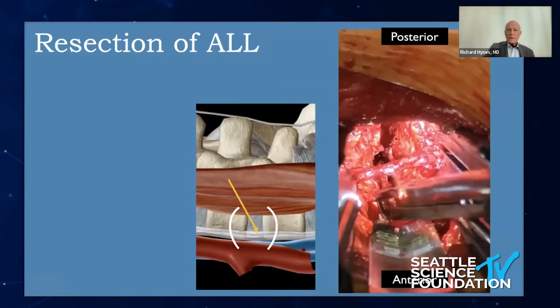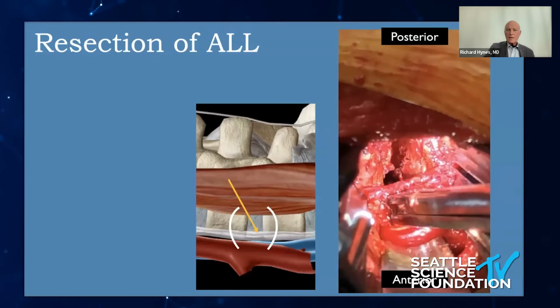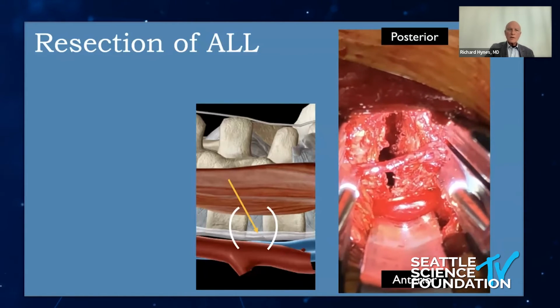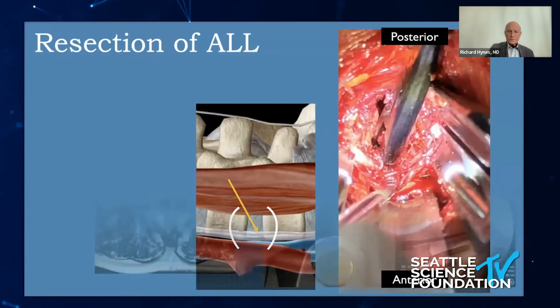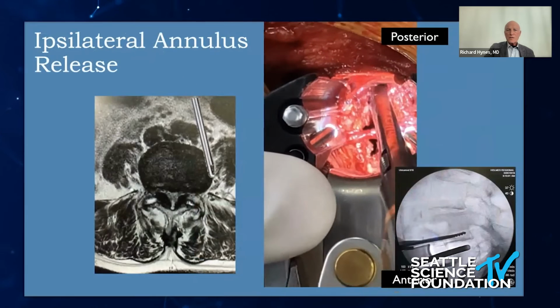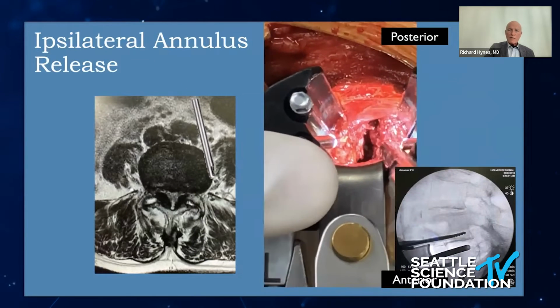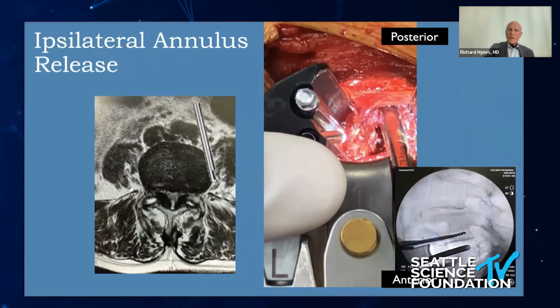And now you can safely, in direct view, remove the ligament carefully without any concern because you're seeing everything, no blind work here at all. You could have a terrific vascular injury if you're not careful with this. And so this is just showing taking up the advantage of O-lift, getting up under the psoas and removing the rest of that annulus, which relaxes the disc space, far lateral herniations, and it makes it easier for the implants to correct the lordosis.